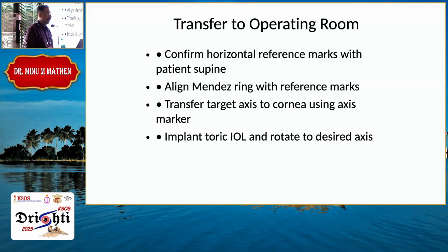And then daily at least 4 or 5, they are 5 degrees off, 10 degrees off on one side, the other will be correct. So one will be correct, one will be wrong. So you have to train 1 or 2 people and they have to do it properly, or you yourself do. Otherwise the patient will come back to you only if it goes off axis.